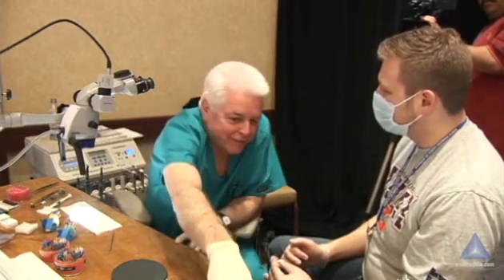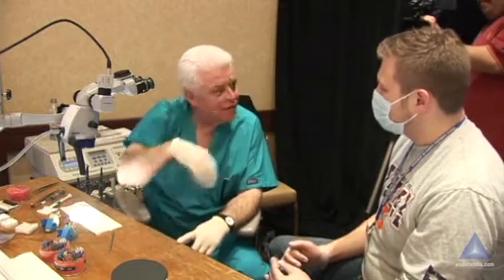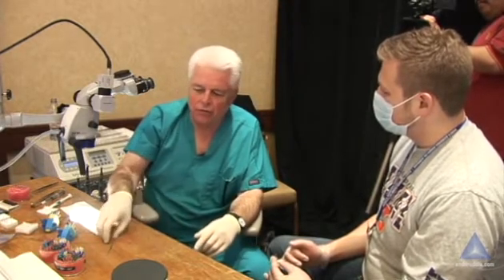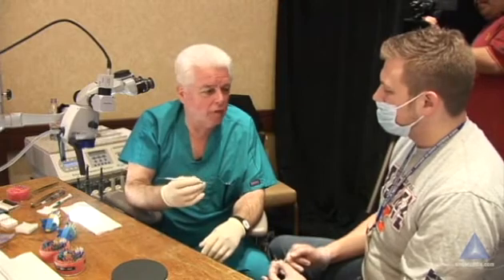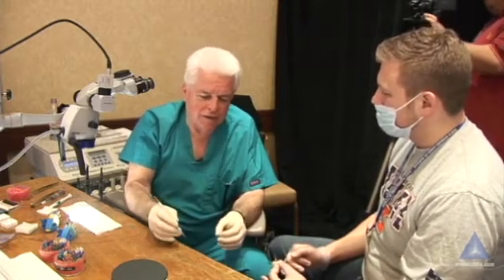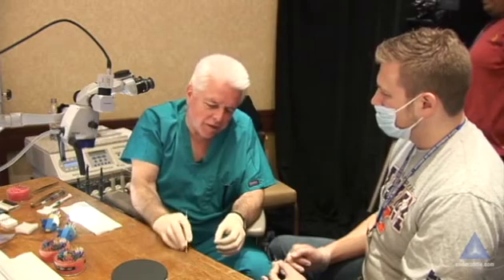I've used the endo activator before to throw the sealer around. But pretty much now with sealer, with carrier-based, I've learned — I'll be honest. I've probably done well over two to three hundred carriers on extracted teeth just to really understand what I'm trying to teach. Then clinically I've done it like 30, 40 times, because I'm a warm vertical guy. So I've learned from others and tried it different ways, and now I'm just taking the sealer and picking it up off the pad.